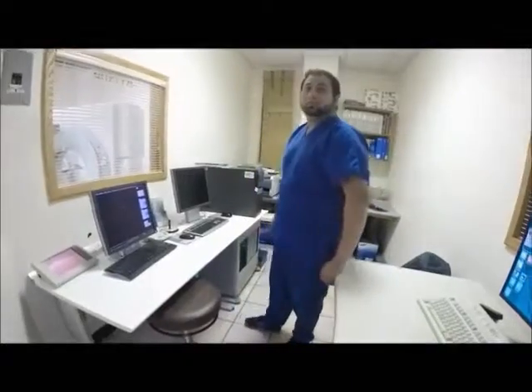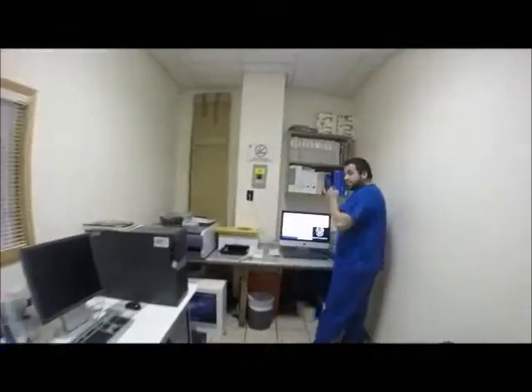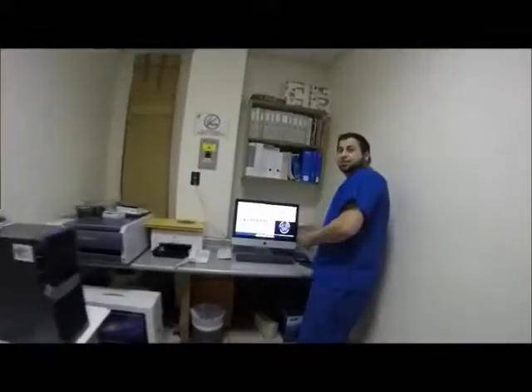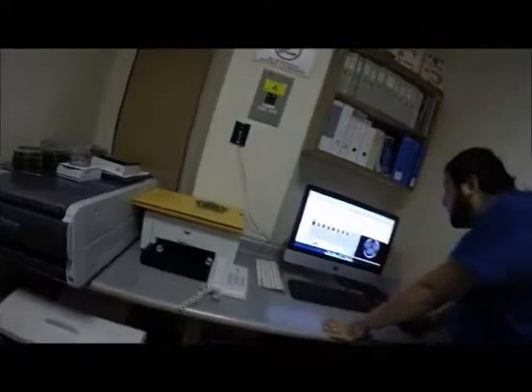The computer workstation that processes the imaging information is located in a separate control room where the technologist operates the scanner and monitors your examination in direct visual contact, and usually with the ability to hear and talk to you with the use of a speaker and microphone.